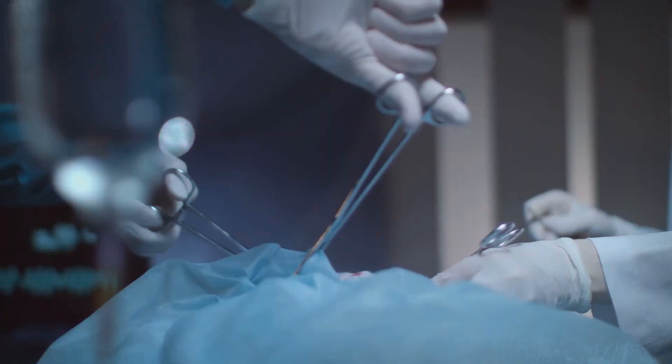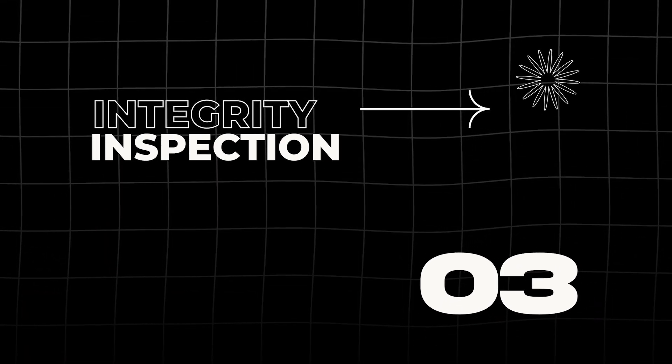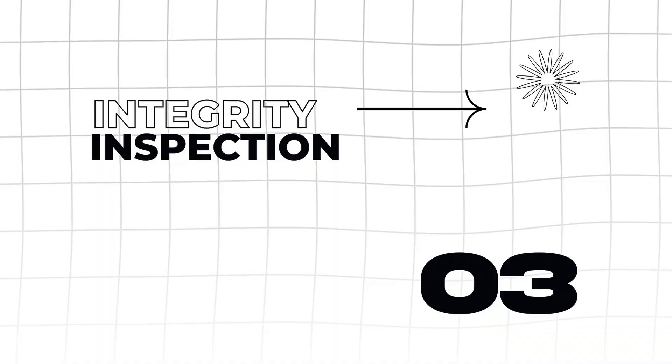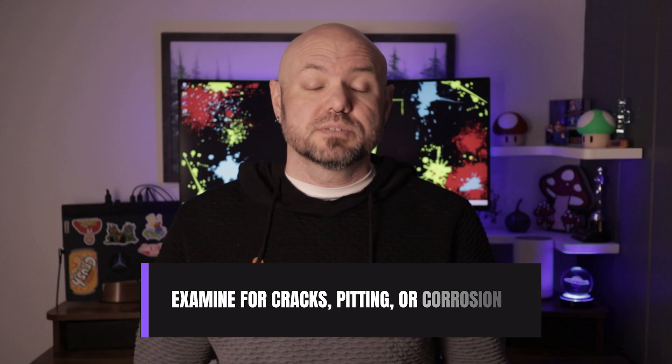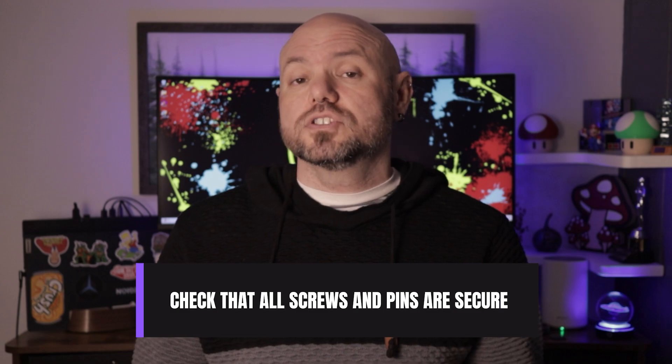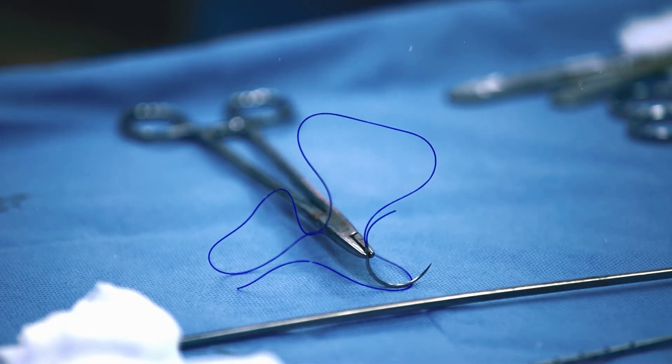Also test the insulation on laparoscopic instruments to make sure there are no compromised cracks or areas where a patient could be burned. Any instrument that doesn't perform as expected should be repaired or replaced. Finally, integrity inspection ensures that instruments are structurally sound. Examine for cracks, pitting, or corrosion, especially in areas exposed to moisture. Check that all screws and pins are secure — loose components can lead to instrument failure and retained devices inside a patient after surgery. Inspect alignment: forceps and needle holders should meet properly without gaps. Any defects must be addressed immediately.